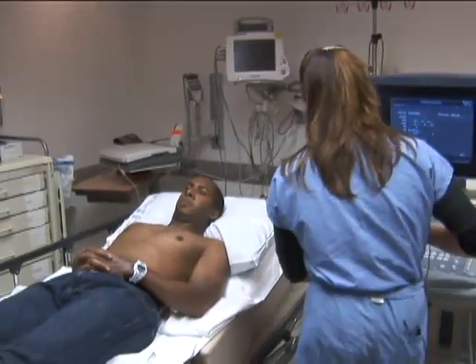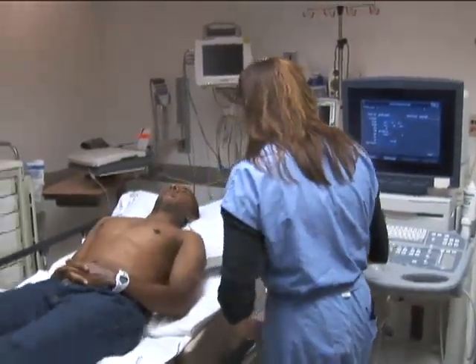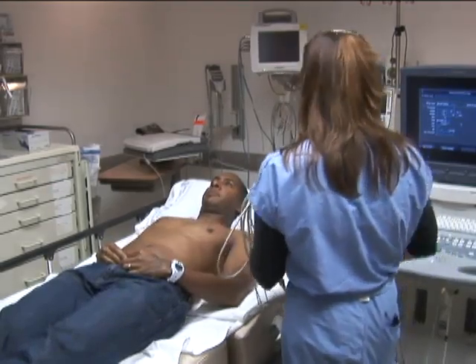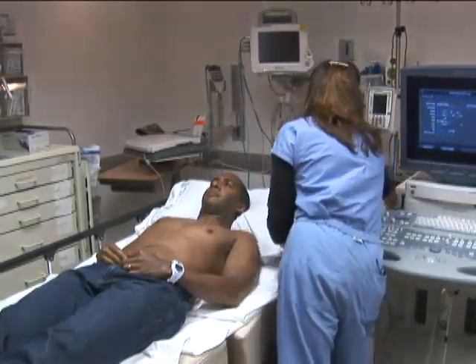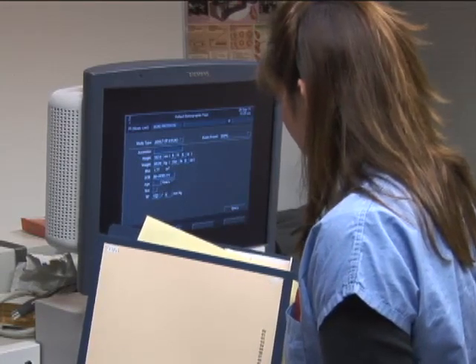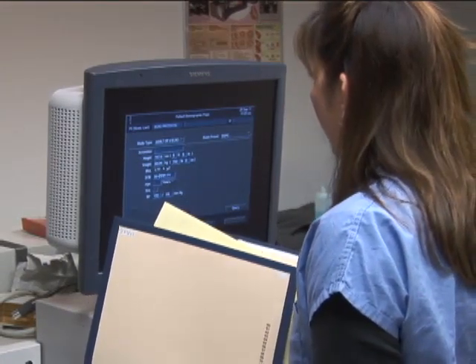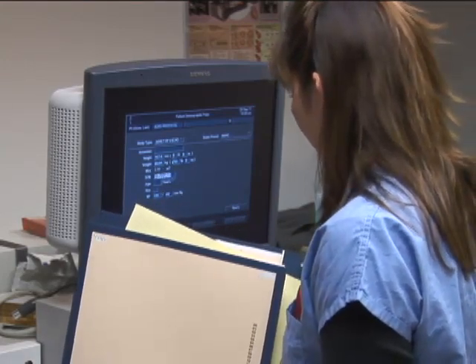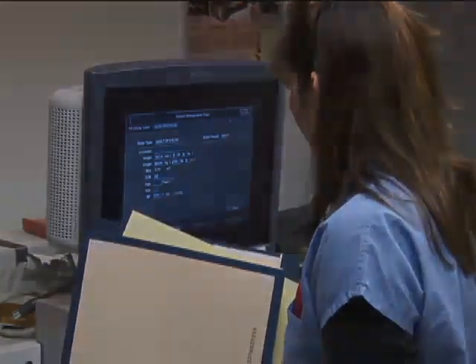At the start of the transthoracic echocardiogram, the indications for study are reviewed, along with any relevant information from the patient's chart, for example, prior cardiac surgical procedures. For follow-up studies, the images and results of the previous exam are briefly reviewed.